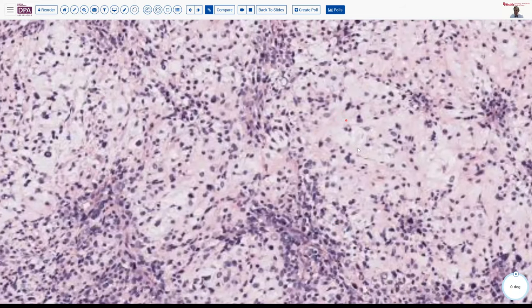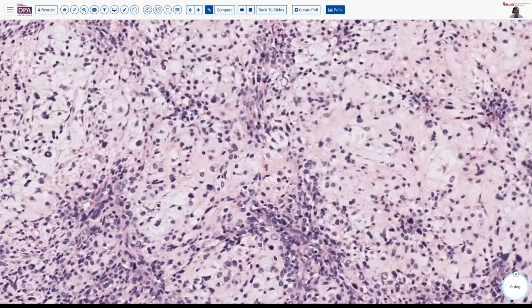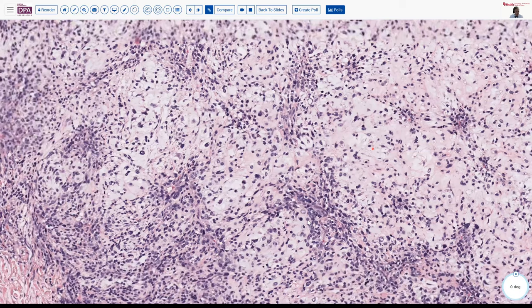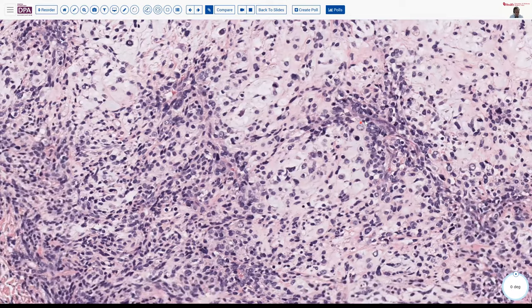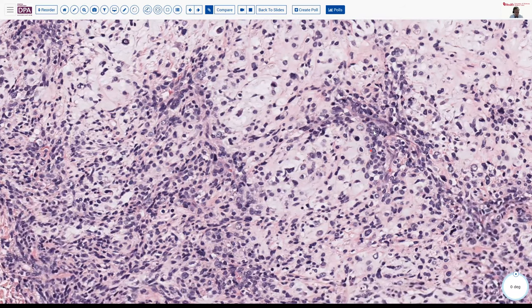We have a number of areas where we've got a sort of loose myxoid and somewhat chondroid appearance. So we don't have classic chondroid lacunae, but we do have this sort of matrix type of appearance around it that looks like a cartilaginous tissue, and it's fairly low grade in these locations. But then in addition, we have these peripheral areas where we have more blue type cells, say like right here. We've got a cluster of small blue cells, not terribly unlike the chondroblastoma that we just looked at, but this is obviously in a very different location. So we wouldn't even think chondroblastoma in this situation.